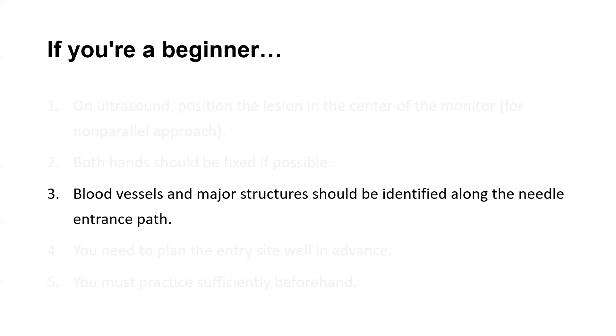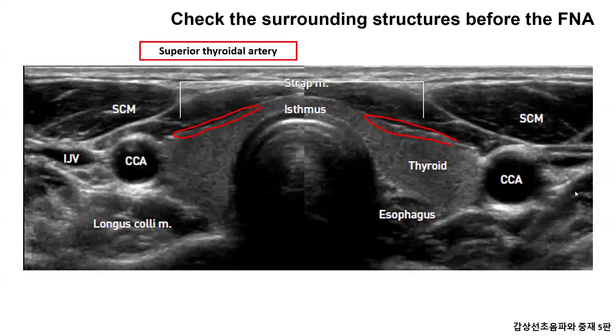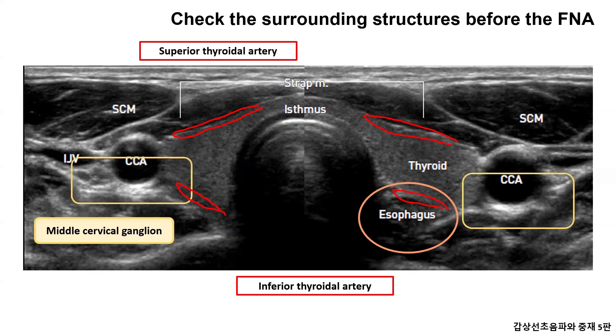Now I'm going to show you the structures you need to be careful of when the needle goes in. There is a superior thyroid artery at the front of the thyroid gland. It is easy to see artery pulsation when you look at it on grayscale ultrasound. There is an inferior thyroid artery at the back, and when you do the to-and-fro motion, you need to handle it delicately so that the needle tip does not go too far back. There are middle cervical ganglions around the common carotid arteries on both sides.